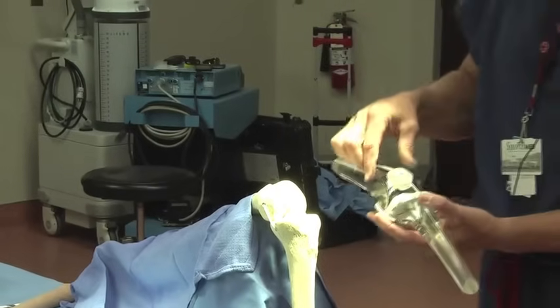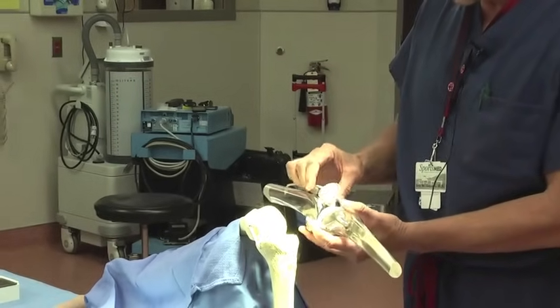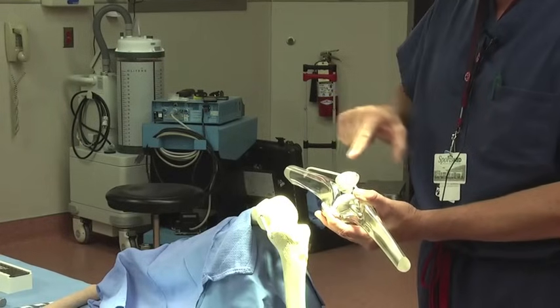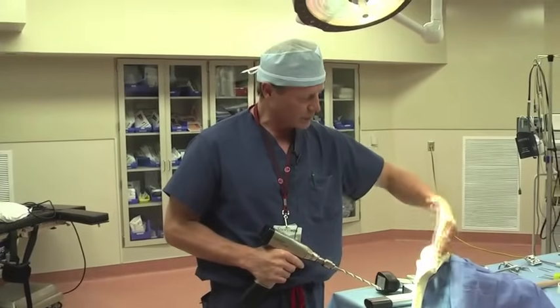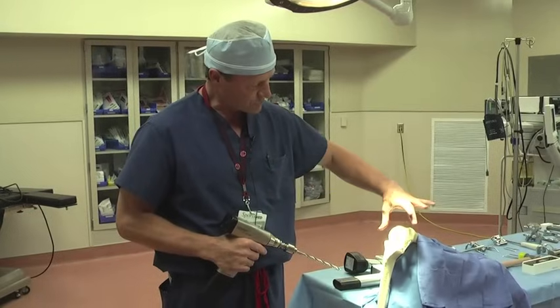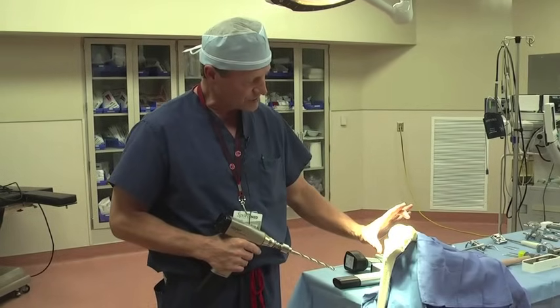On this model, we'll demonstrate that we rotate the kneecap out right here, and then what we actually do is we take off the spurs — or what we call the osteophytes — and then make a cut where we make it flat on the patella and put a plastic button on. Once we've prepared the patella, we evert it out and we have a retractor that holds it out of the way, and a retractor from the inner side that holds the soft tissue, giving us good access to the knee through a limited incision.